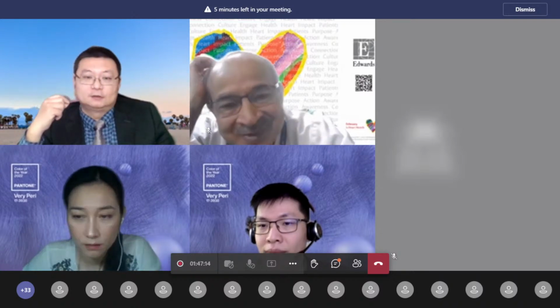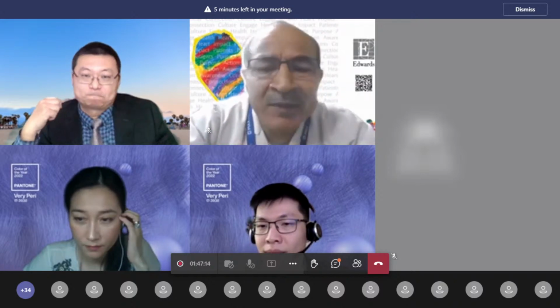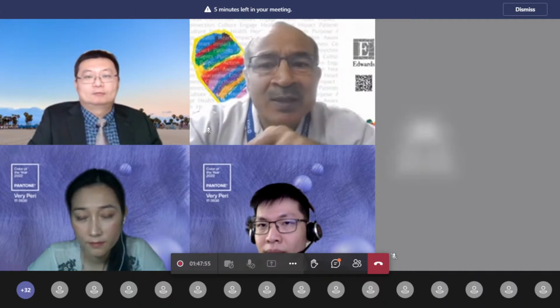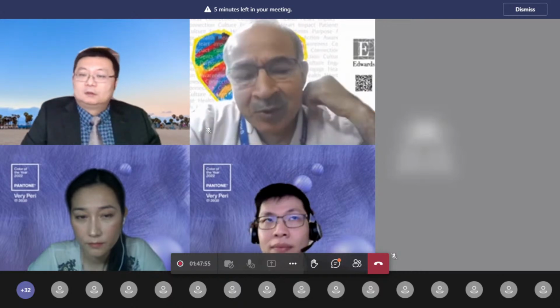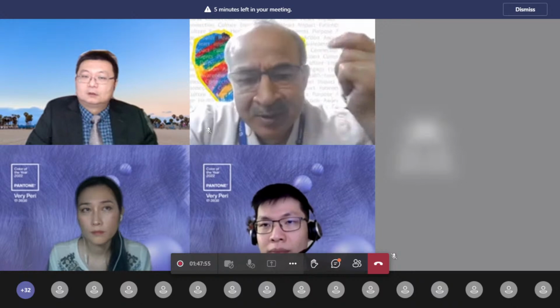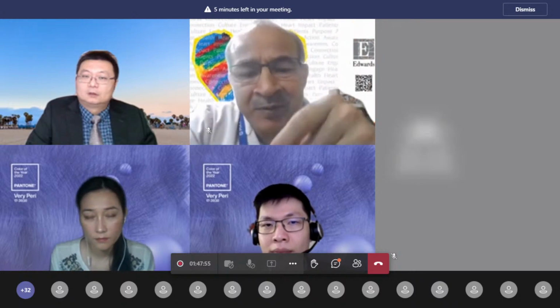So occasionally we see knotting. But knotting doesn't hurt us because when we pull the Swan-Ganz, it comes out of the heart only at the level of the neck. So sometimes our cardiologists go to the cath lab and unknot the catheter, or at worst we just pull it and put pressure here.